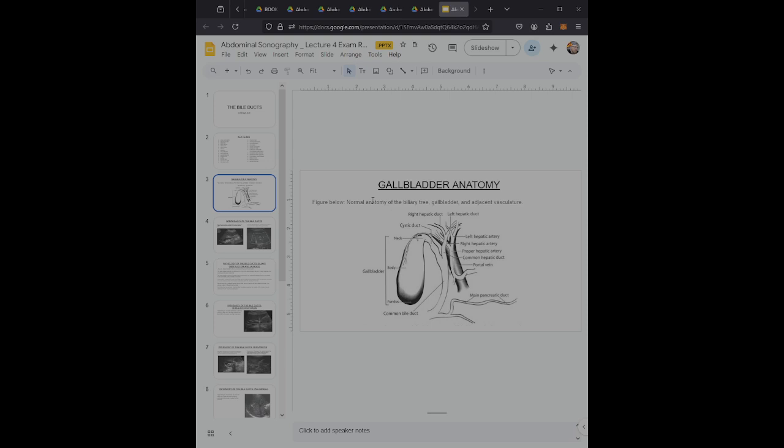in the gallbladder. Now the gallbladder is attached to the biliary tree by the cystic duct, and the point of attachment marks the proximal margin of the common bile duct. The cystic duct contains quite small structures. We call them the spiral valves of Heister, and these are small projections of tissue that prevent the cystic duct from distending or collapsing.